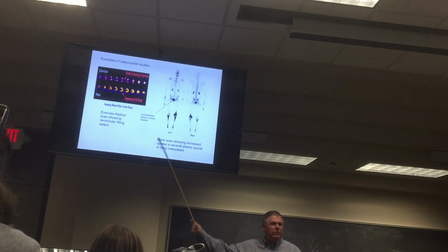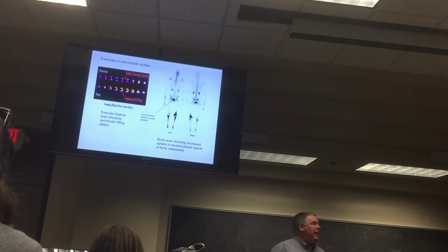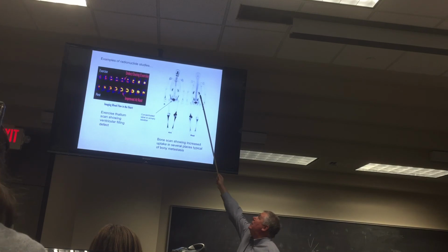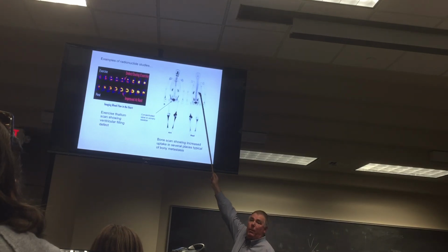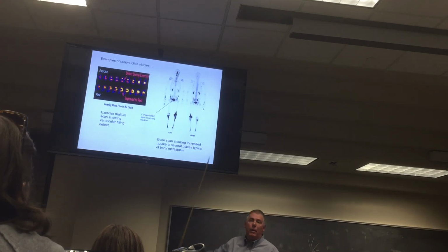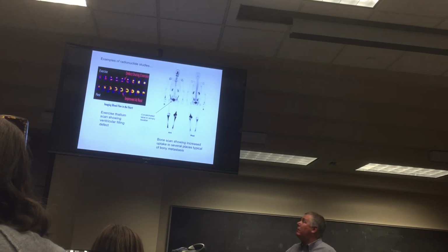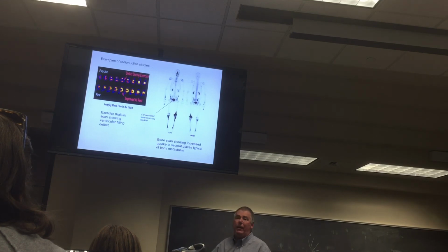Remember we talked about it in anatomy? Did we talk about anatomy? Osteosarcoma being involvement of the knees mostly. Notice that this stuff gets filtered by the kidneys. So the kidneys will show up and it's deposited in the bladder. There you go. This image over here is called a thallium scan.